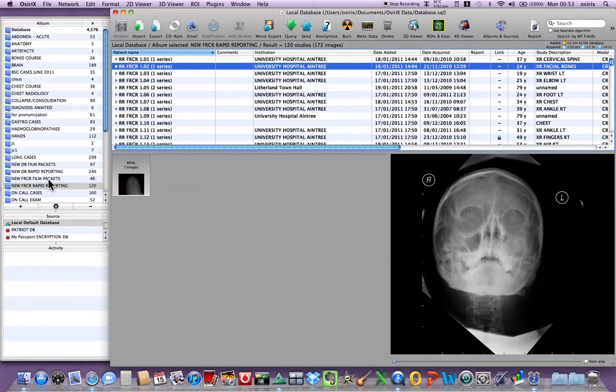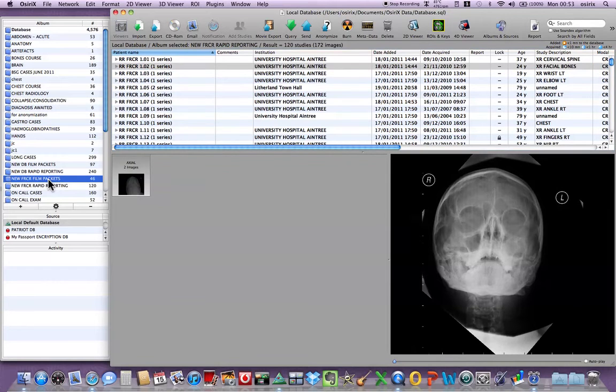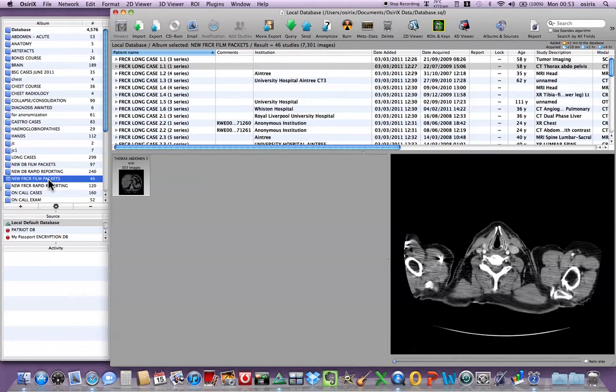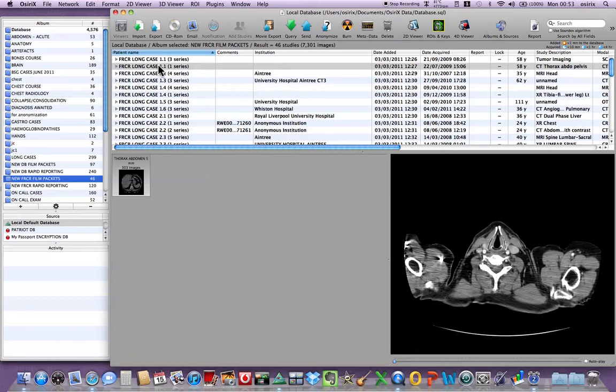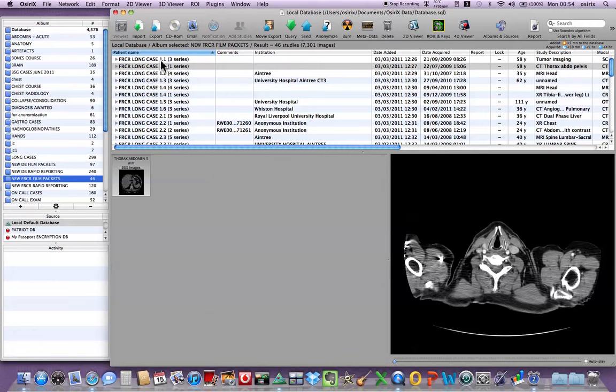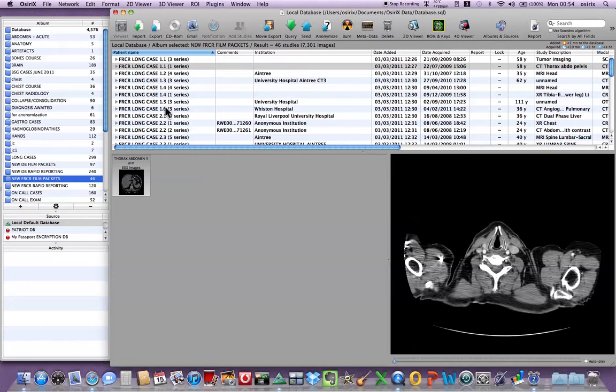From the film packets point of view, I can go into the film packets and as each film packet has six cases, I'm going to ascribe the cases in film packet one, 1.1, 1.2, 1.3, 1.4, 1.5, 1.6.